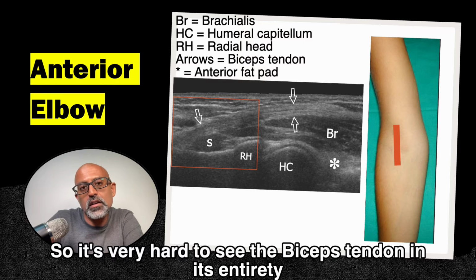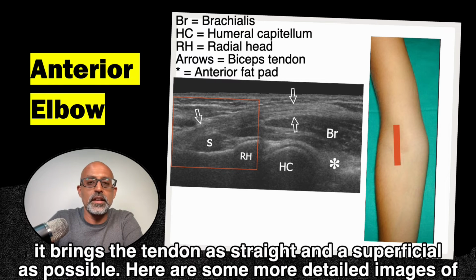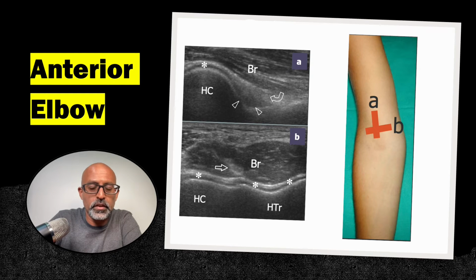So it's very hard to see the biceps tendon in its entirety. And sometimes what we need to try and do is to hyperextend the elbow if possible, so that it brings the tendon as straight and as superficial as possible. Here are some more detailed images of the anterior elbow.